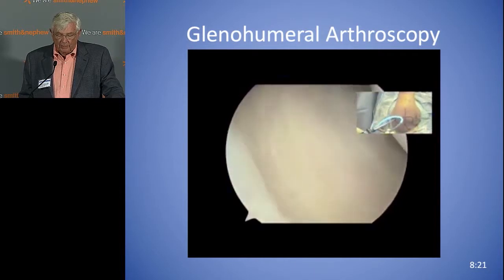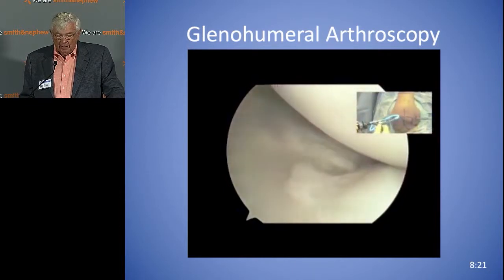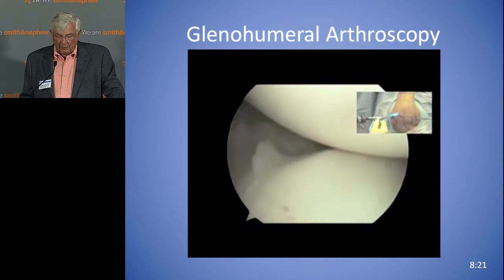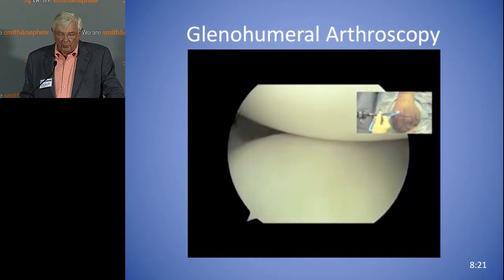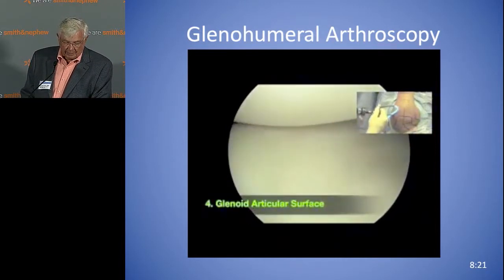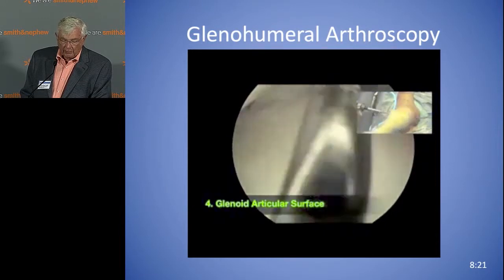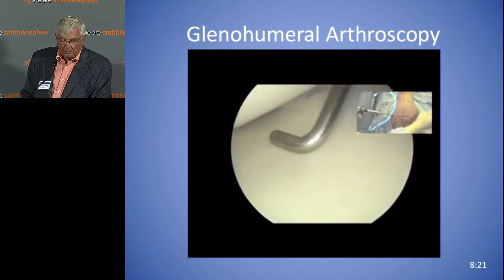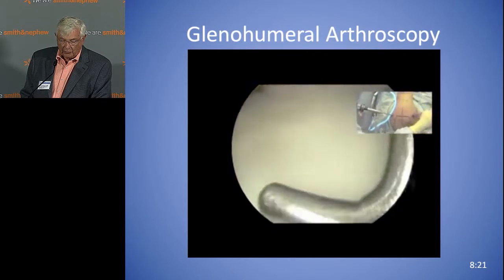Now you have to make two moves to see the articular cartilage — if you just do it once, I think you'll miss something. So now we'll look at the glenoid. You can look at the glenoid both for the bare spot — if you have an instability, there's not much of a bare spot in this patient. Also look for osteoarthritis of the joint. I usually take a lot of photographs to remind the patient that they have an arthritic joint.